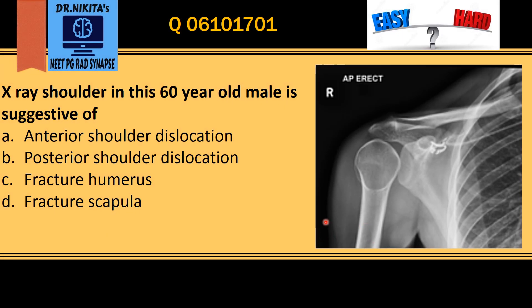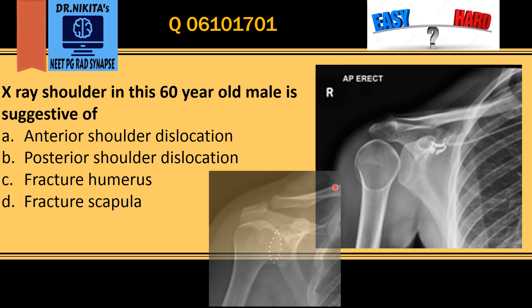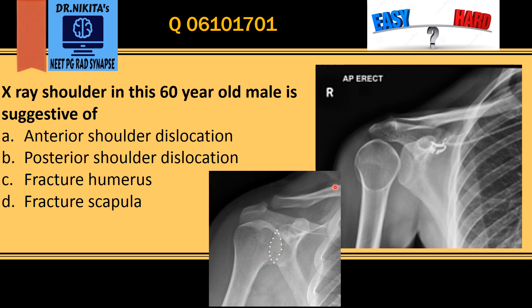We have to identify the abnormality in this X-ray shoulder AP view. Before that, let us look at the normal X-ray shoulder. In a normal X-ray shoulder, the head of the humerus and the glenoid are congruent, and there is an overlap between the two in the form of a half moon.